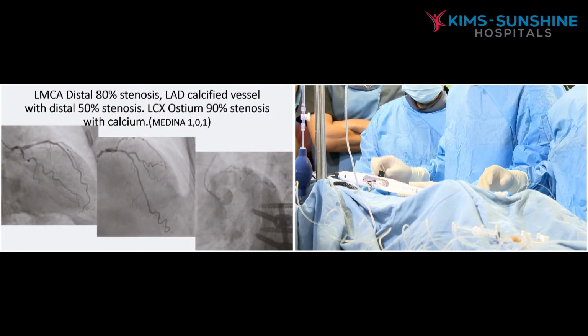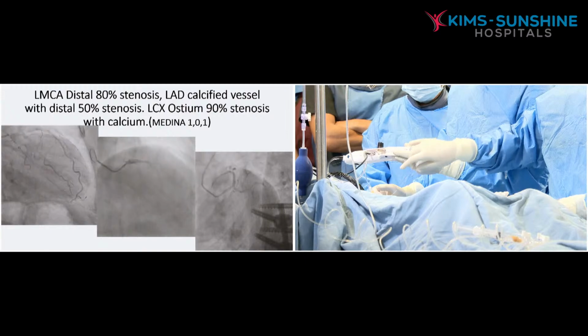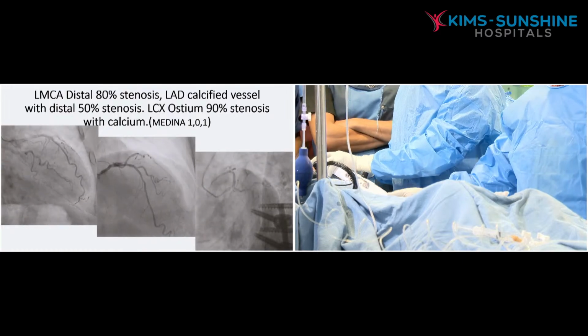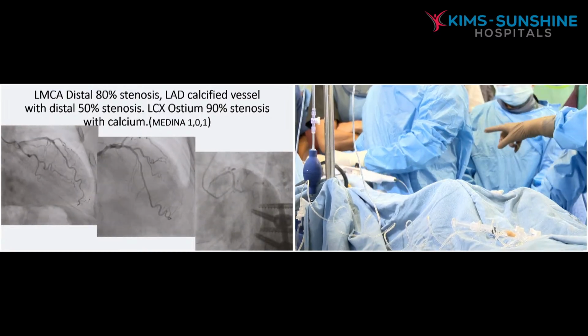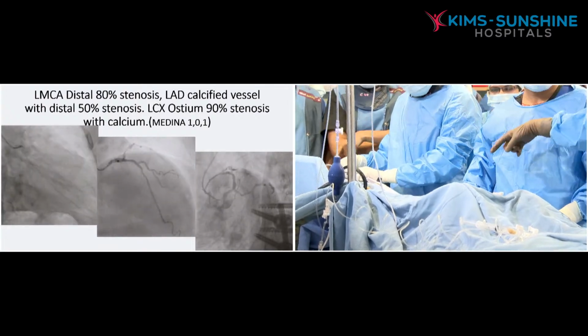Yeah, that's it. Okay. Only 90-degree movement. Yes. 90 degree. Not 360. Okay, let it go. Little tug, sir. Keep the butt straight. Yes. What you do, you can keep it at the backside with the brake, and you keep it inside also.